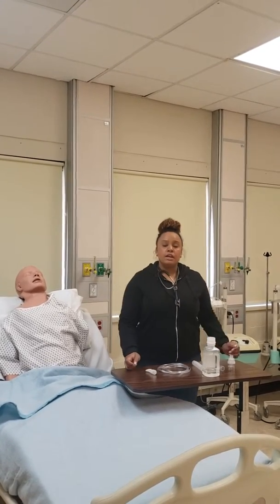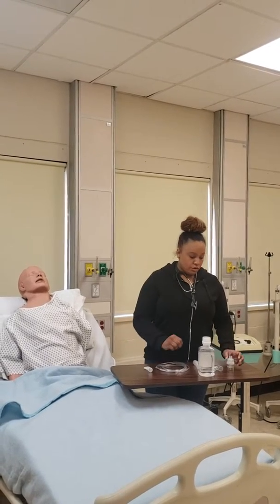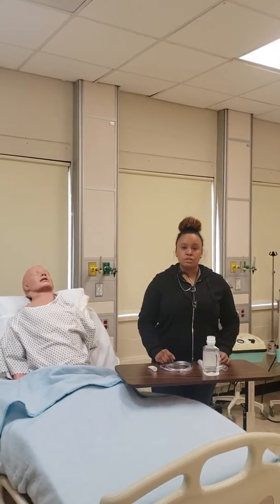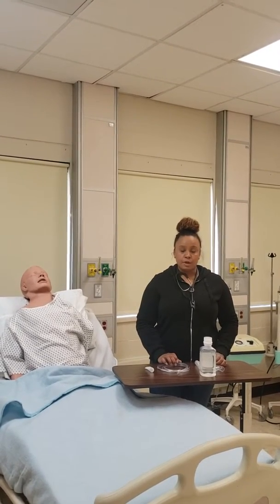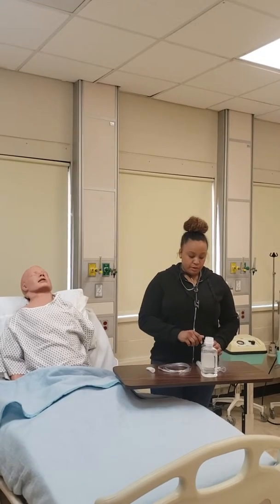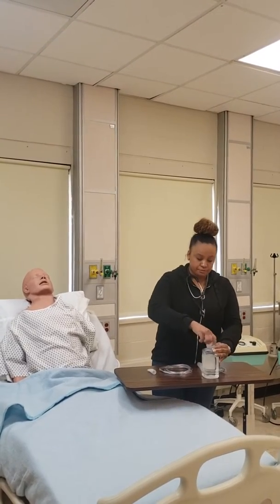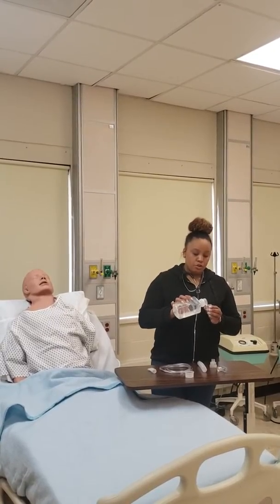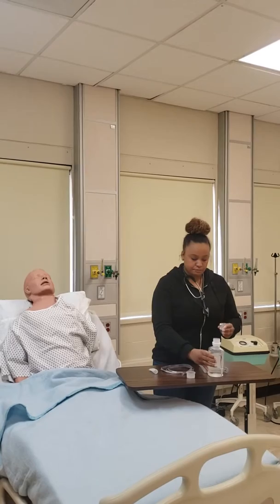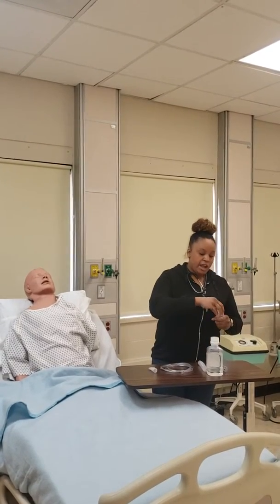I will now be assembling my aerosol delivery device, which is the gas source, the flow meter, the small volume nebulizer, the tubing, and the mouthpiece. I will now be adding 2.5 milligrams of albuterol into 3 milliliters of normal saline. Every 4 hours.